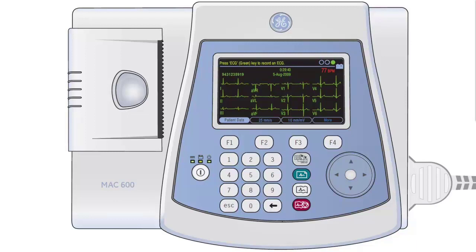Once at least 10 seconds of a good quality trace on all leads has been observed, the ECG can be acquired by pressing the green button. The next 10 seconds of ECG recording will be captured, after which you will be taken to a review screen.